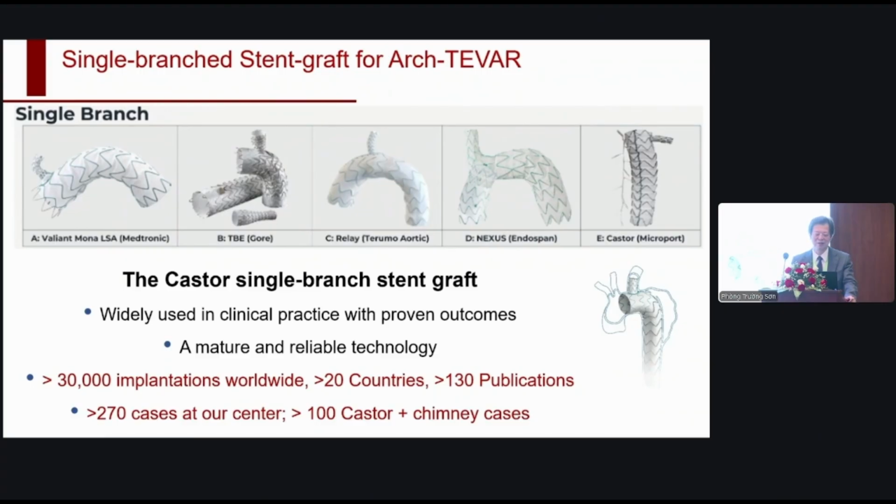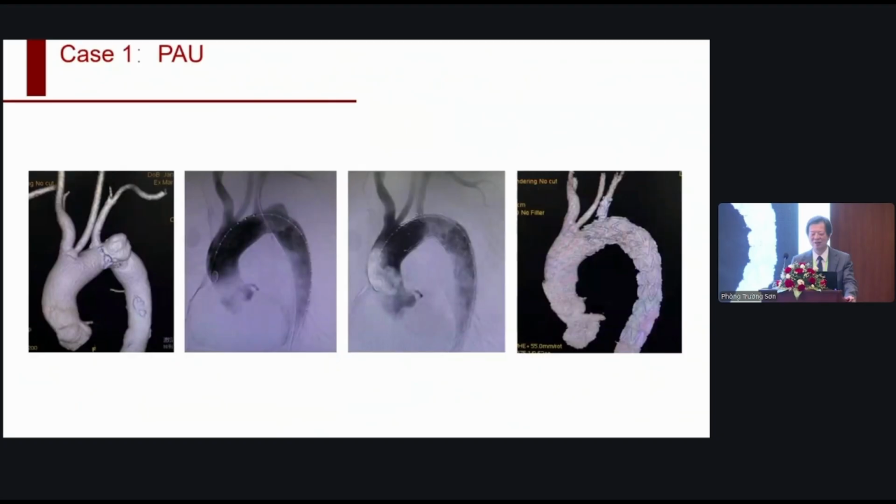We do know that Castor is well accepted in different countries. I also use the Castor device to perform cases in more than 15 countries. Every case gets a very good result. For example, such a case is very simple for you to do, use a Castor. But we have to emphasize, as you release the Castor, you have to listen to the heartbeat. It's very important because at the beginning of the heartbeat, the blood pressure is very high, so it's easier for the Castor to migrate.